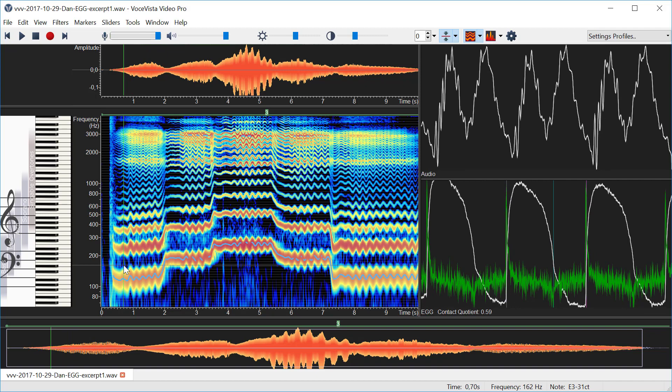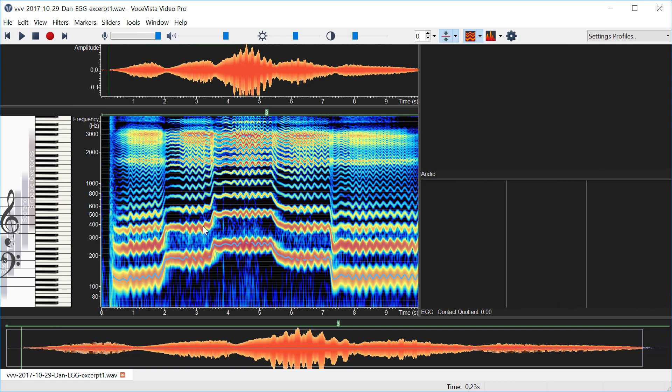That's using an algorithm developed by Christian Herbst which will later be used to display the wavegram that he has developed.